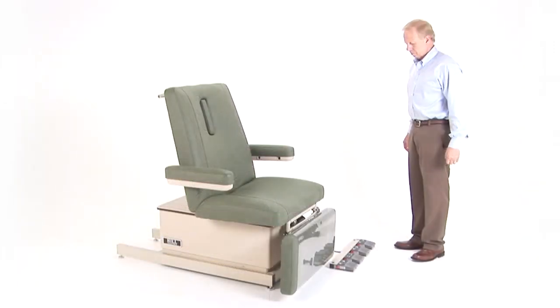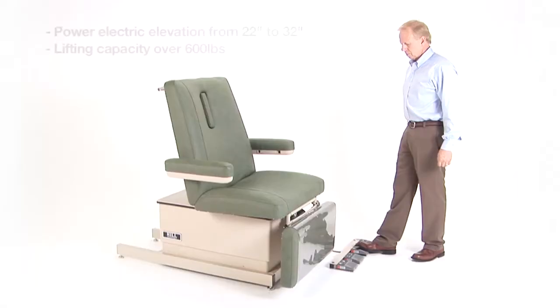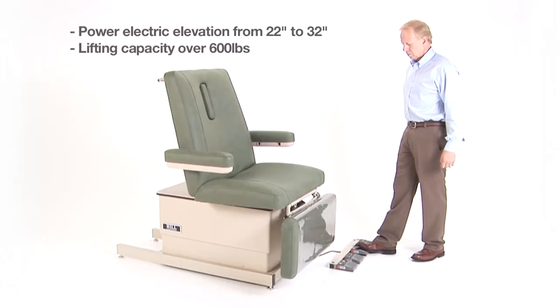The 90W electrically elevates from 22 to 32 inches in height. The lifting capacity is over 600 pounds.